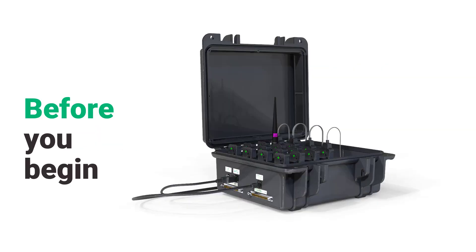Before starting an update, please close all Delsys software applications and dock the sensors in the charger. It is suggested to fully charge sensors before attempting updates. Connect the base station to power and to the PC.